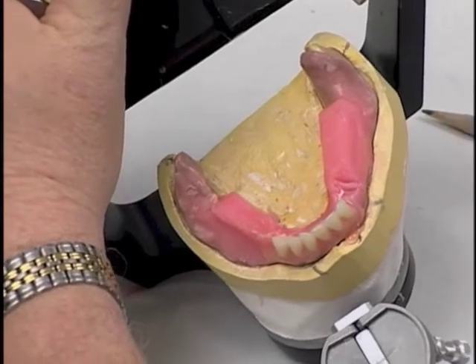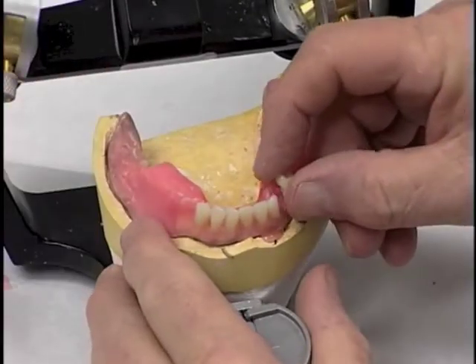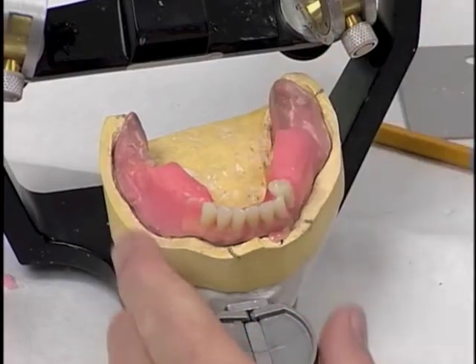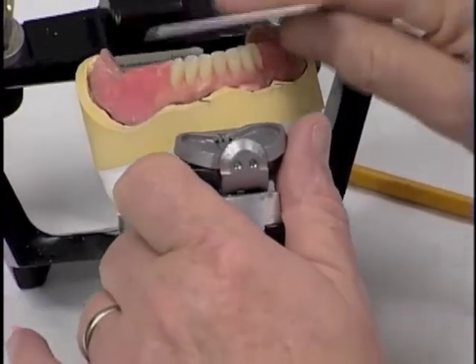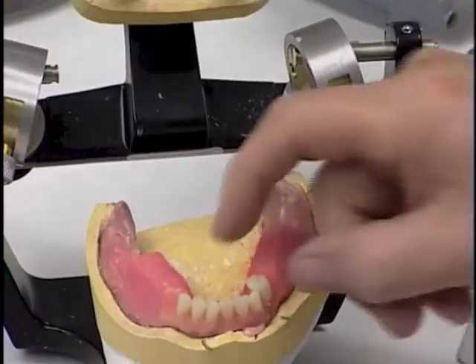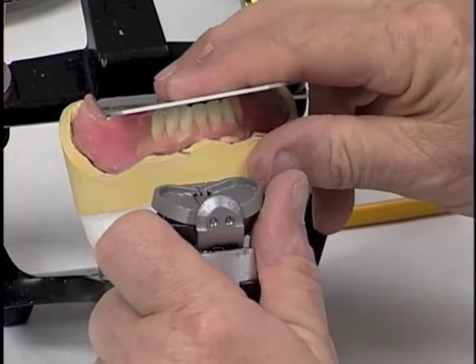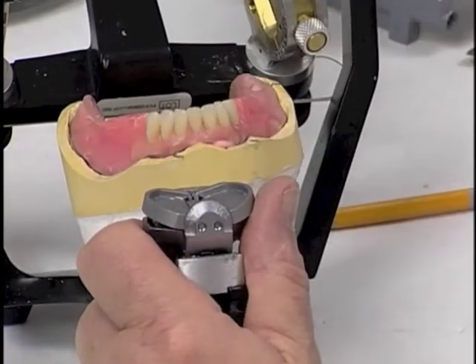Once we have the wax pulled, we're going to place the tooth now. And we would like, if at all possible, to keep that occlusal plane perfectly flat, starting with the height of the mandibular canine. Get the tooth perfectly flat, which means both buccal and lingual cusp are touching the tooth.